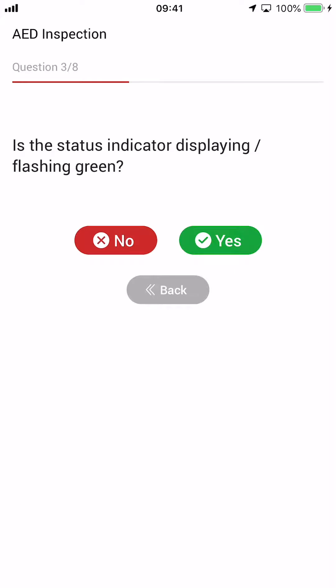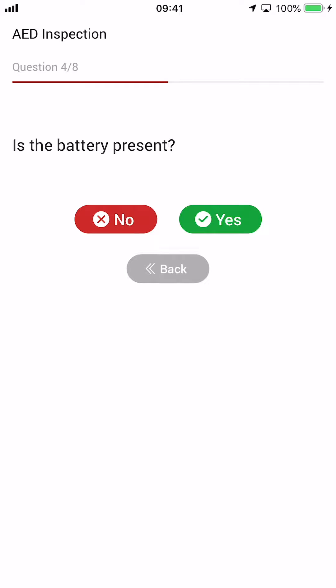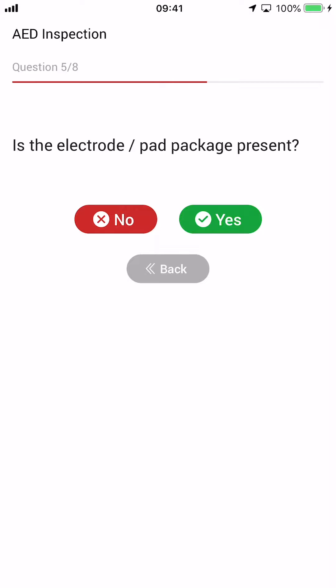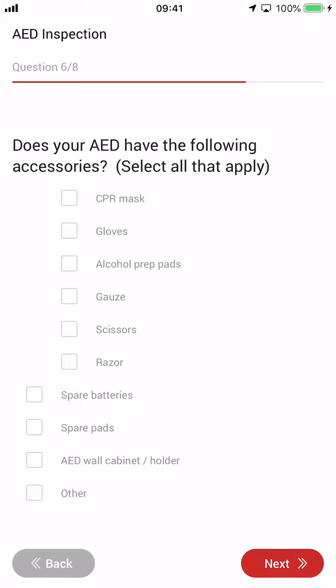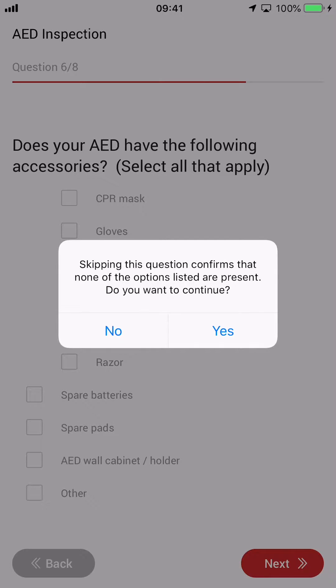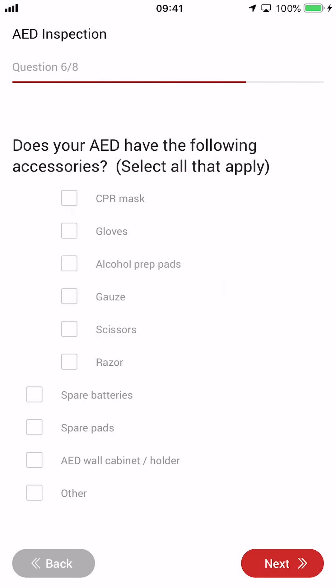Tap Next to start the questions. Simply answer yes or no to each AED readiness question after ensuring the step is completed. Here you may select all that apply. If none apply, simply select Next and a confirmation prompt allowing you to skip the next question will appear.